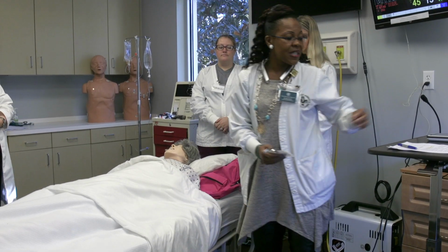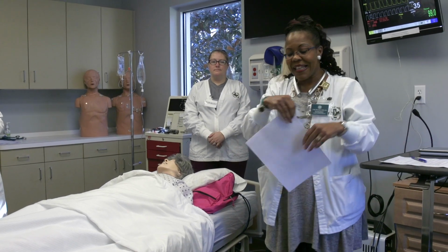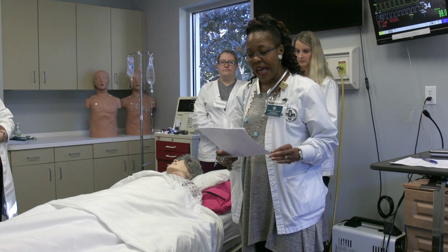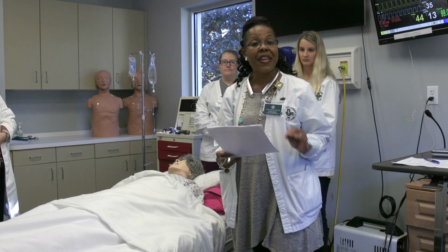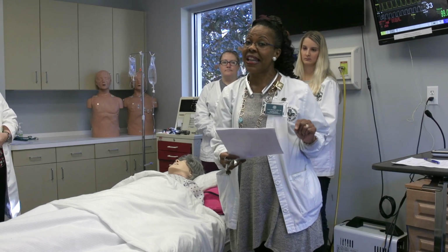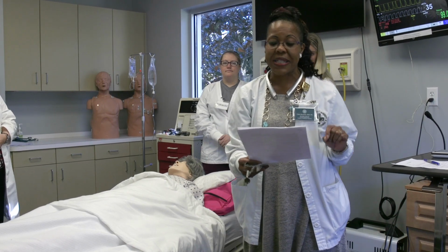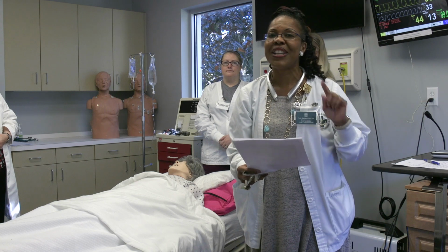All right, let me give you the scenario of what we're working with today in this simulation. We have a 62-year-old female who has been admitted to the hospital for fever and chills, and she's had that for the last 2 days. She has had an influenza swab and is awaiting results. She is awake but drowsy.